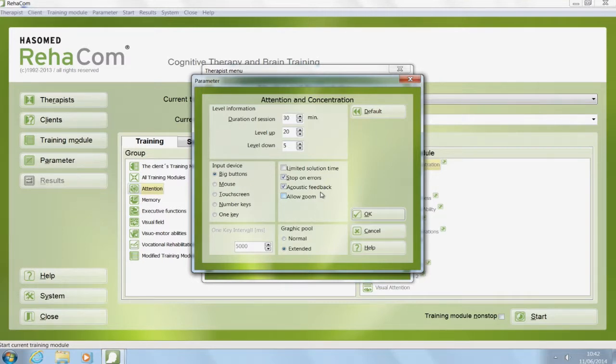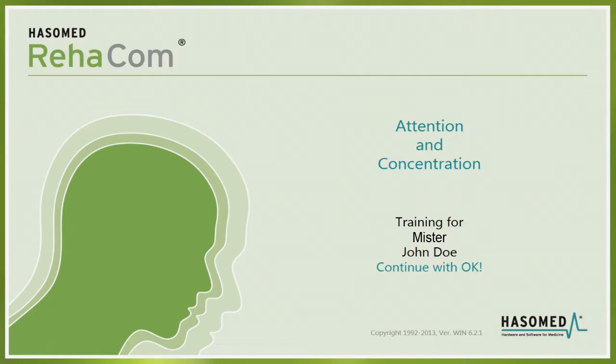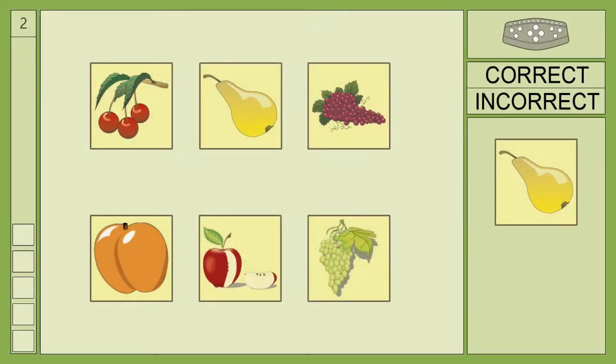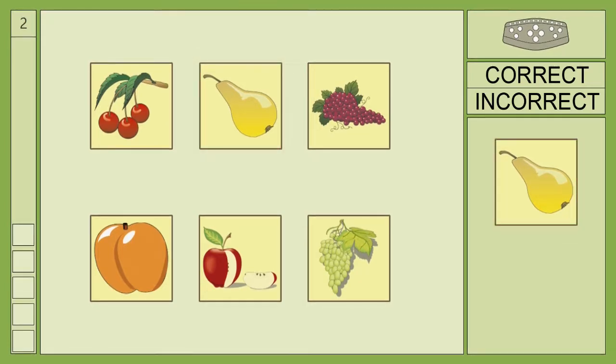It is possible to change these parameters at any time during training. In this module, the task is to find the correct object in a set of presented objects in a matrix. The reference object is shown at the side of the screen, and only one object in the matrix is identical to it.